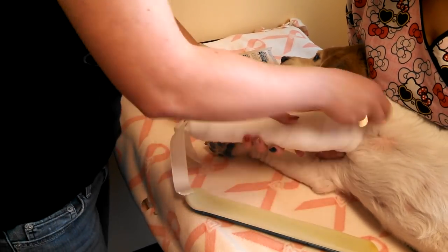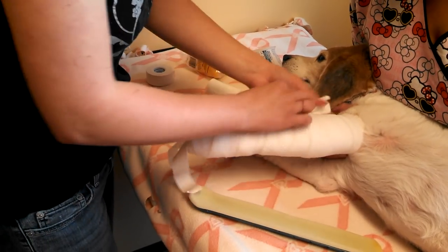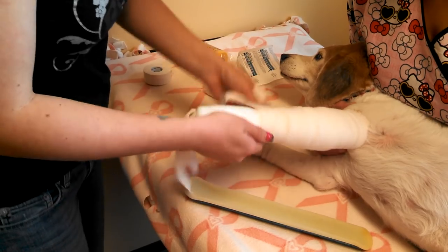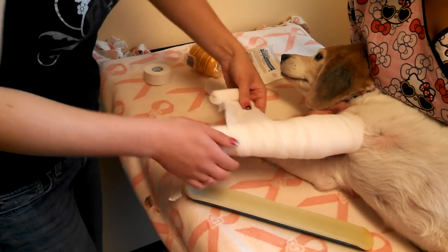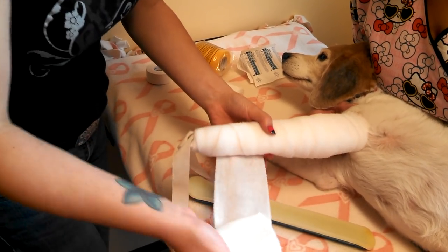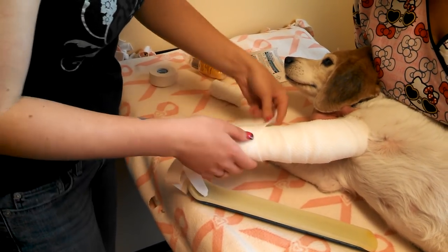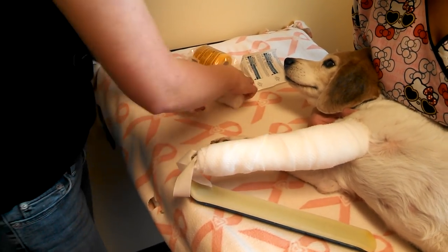And the splint ends — you want to pad them up as best you can so there's no sores. Then you're going to cut off the bandage.